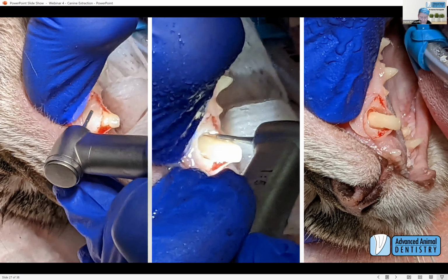Personally, and it particularly happens in cats, also can happen in dogs too, I will have to position a head. So if I'm performing a cut somewhere and the head's actually facing me, it's quite vertical, and fluid, of course, follows gravity and goes down. That's the one time I pack a throat. I generally don't pack throats personally. I'm too forgetful, leaving swabs in. But just be mindful of where fluid goes. It always goes down. So if you make an exit point that's lower than where you're working, it will all go out onto the table or the mat.